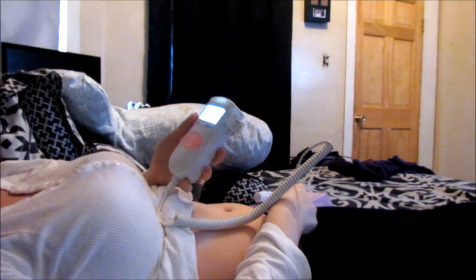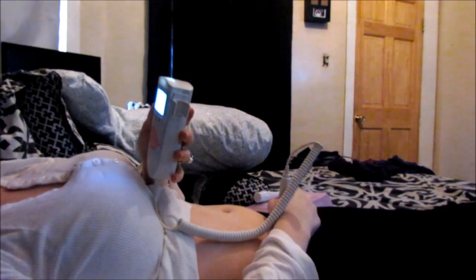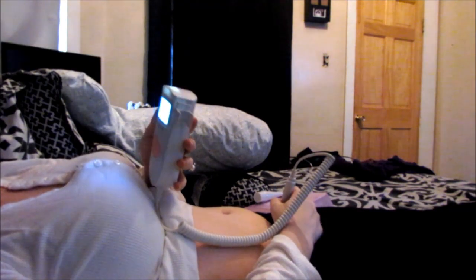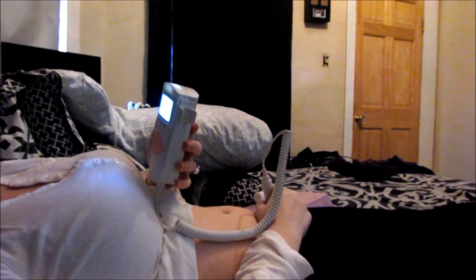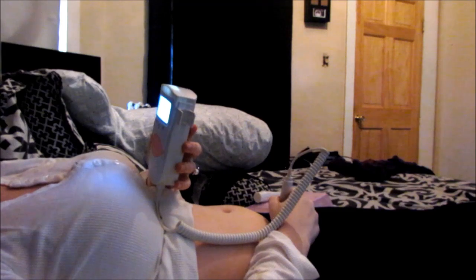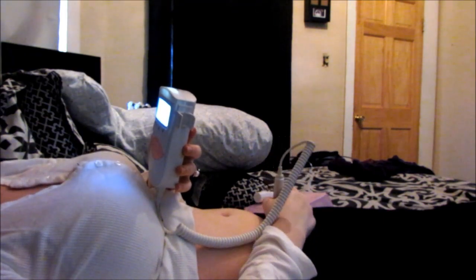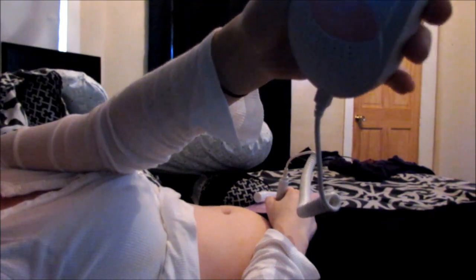I know where my baby stays, so it's going to be pretty easy for me to find it, but I'll show you guys what it's supposed to sound like. It's really low right now, so I don't want to show you guys and you won't be able to hear it. That is what it's supposed to sound like.